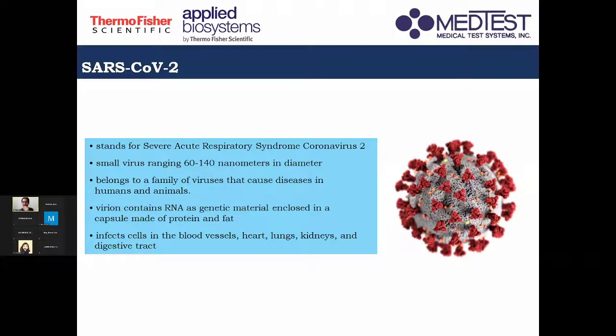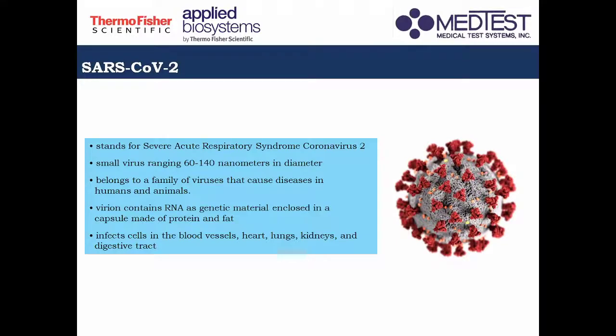But mostly, in order for us to detect the virus infecting a human, we usually collect samples from the nasal area and the mouth area.